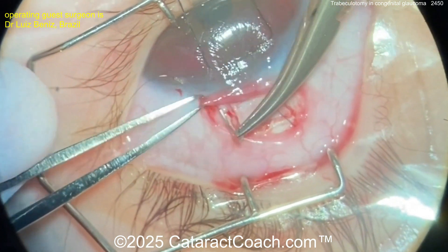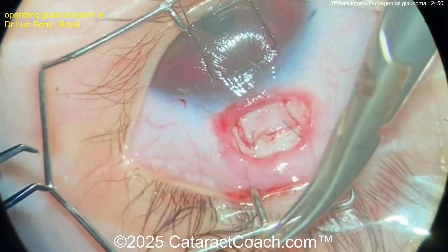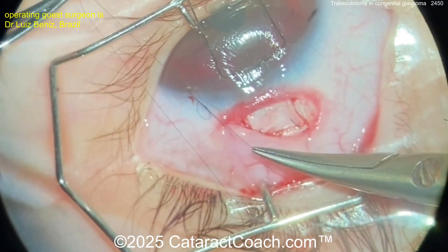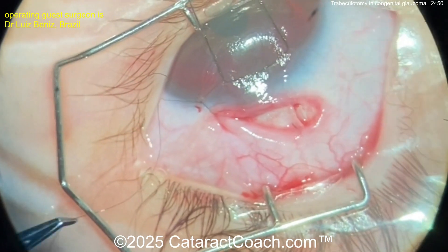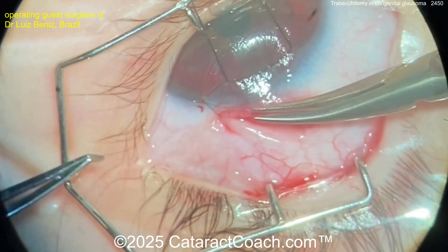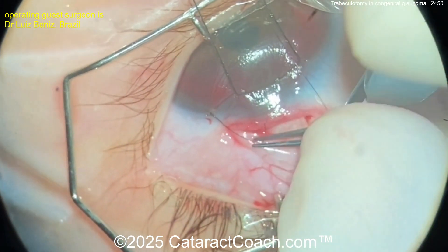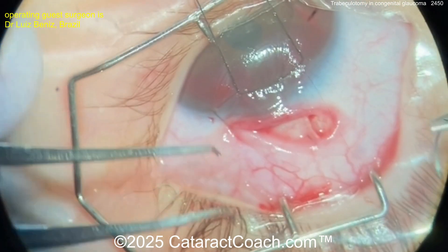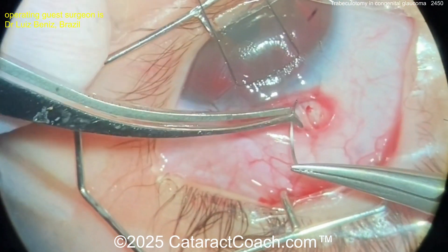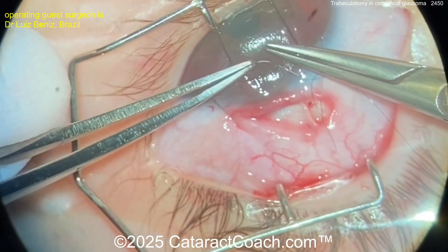Bury those sutures — get those knots buried; you don't want that exposed. Now you're going to suture up here. You probably want to use a small gauge Vicryl so that it can dissolve on its own, because you don't want to have to bring the child back to the operating room to remove a suture — and obviously at this age you're not going to be able to remove it in the clinic. Suture going down there, tying this up. You definitely want to get this completely watertight. That traction suture in the cornea has really made this a lot easier.